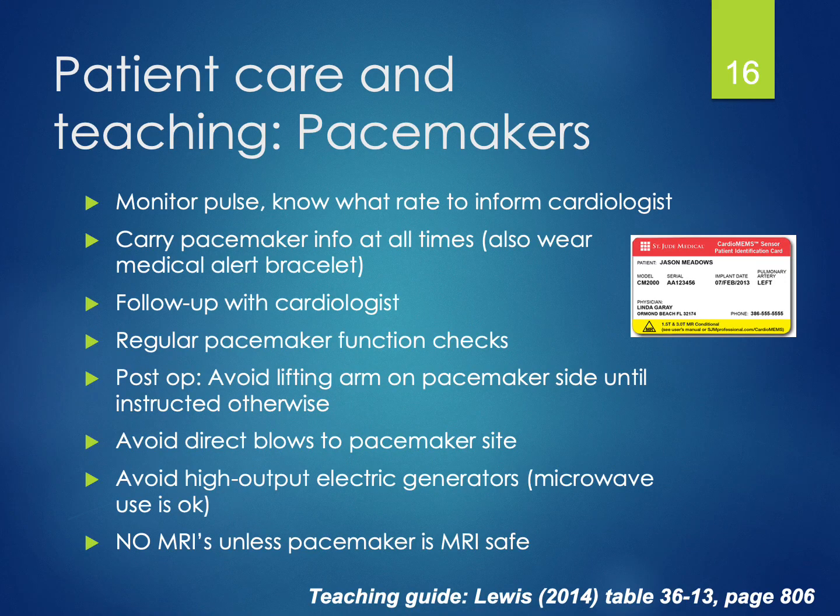So once our patient has a permanent pacemaker implanted, there are some important points to consider and discuss with your patient. And just remember, as with any patient teaching, this individual has just undergone a stressful event like surgery. They could be scared or intimidated, and they may not process everything you say the first time around, and just handing them a packet is not enough. You need to find a teaching guide and something to provide to them to refer to and have them teach back as well. So you'll find a teaching guide in your text that you can refer to for some details.